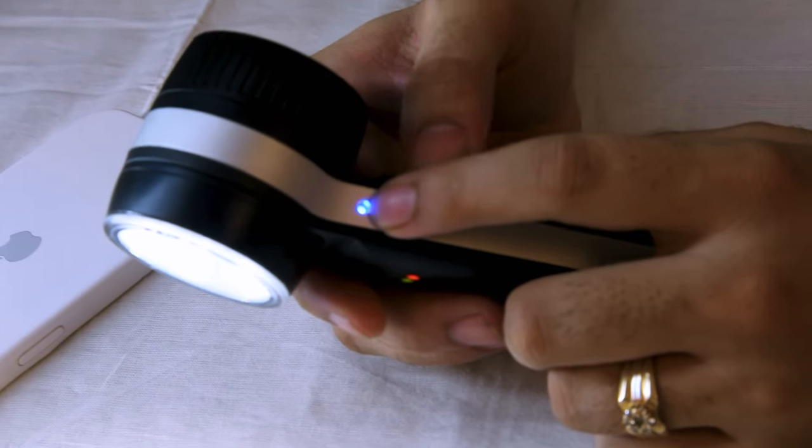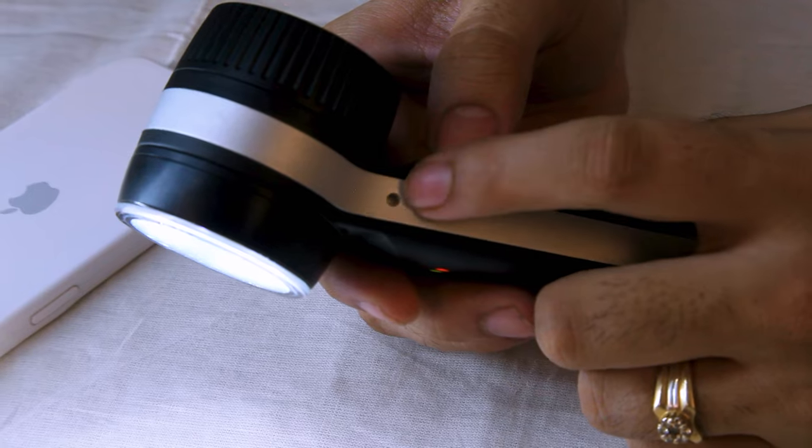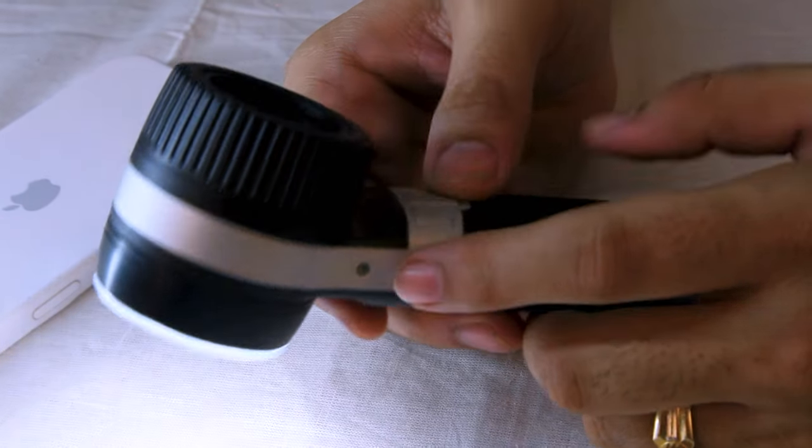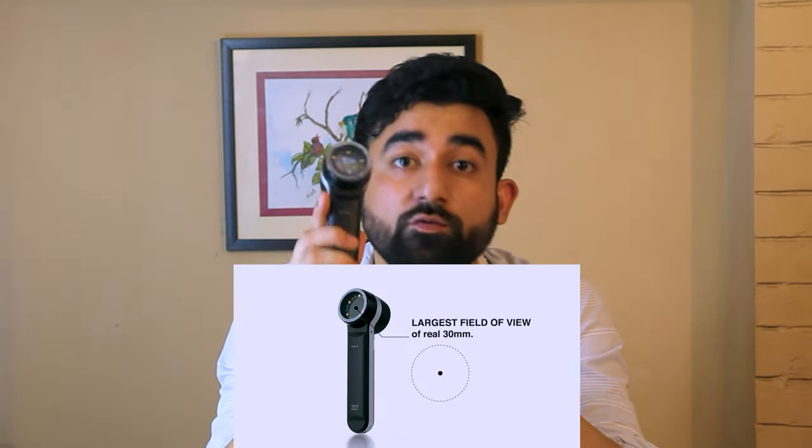When the polarized button is on, the polarized light is active; when off, it is deactivated. The polarized button helps eliminate unwanted light so the image becomes clear. This device supports both contact and non-contact examination modes.